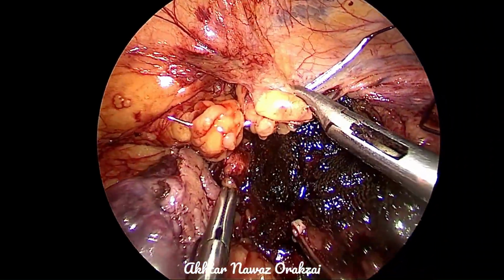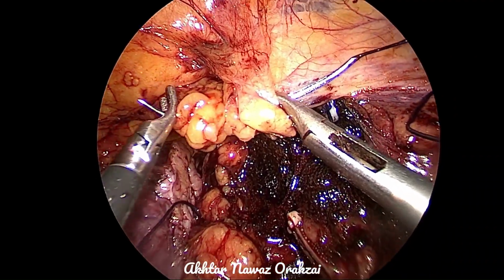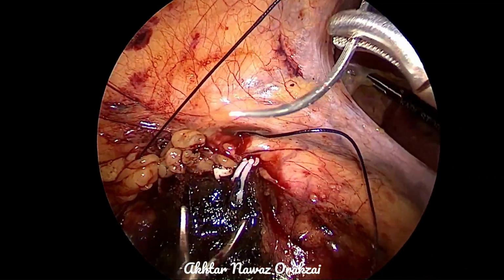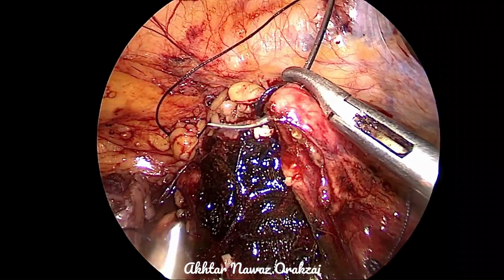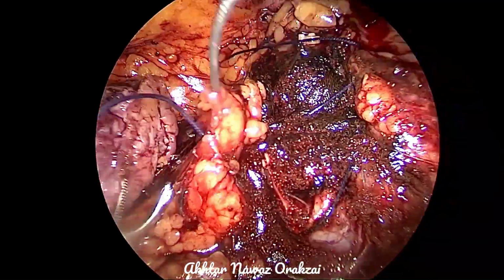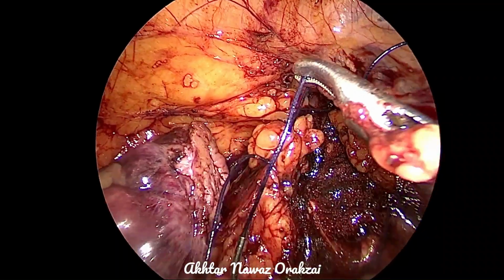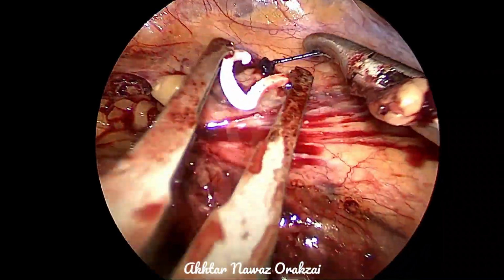So we have removed one needle of Vicryl 2-0, and we have also removed the two bulldog clamps. And now in the third layer, we are covering the defect by repairing the Gerota's fascia so that all the layers are restored.